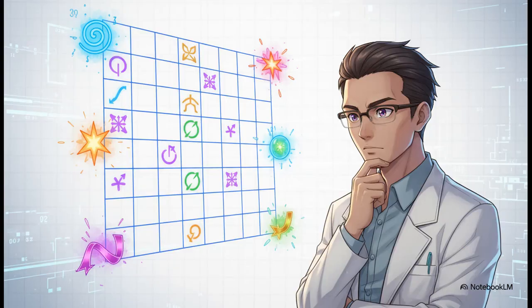Okay, probably the easiest way to wrap your head around this is to think of a Sudoku puzzle. The sinogram is kind of like getting the sum totals for every single row and every single column, all at once. What Radon proved, and this was his genius move, was that if you have all of those totals, you have all the clues you need to work backwards and figure out the value of every single little box. And boom, that's your final image.